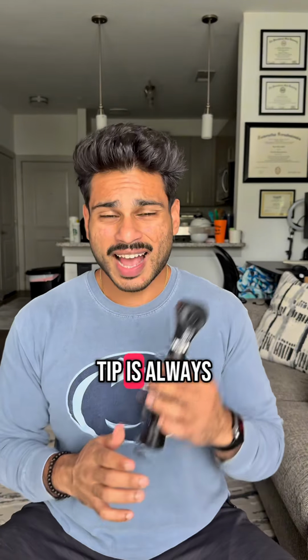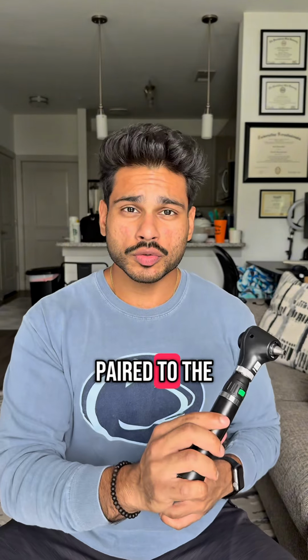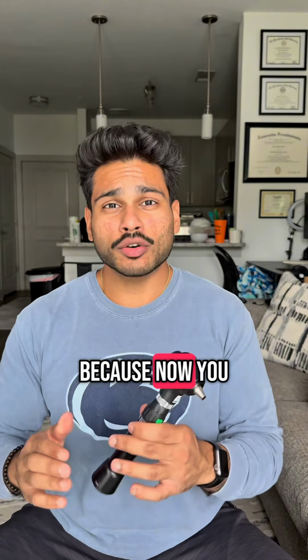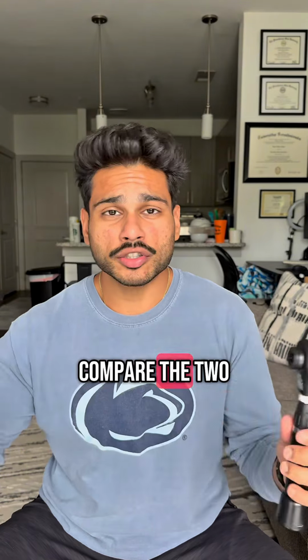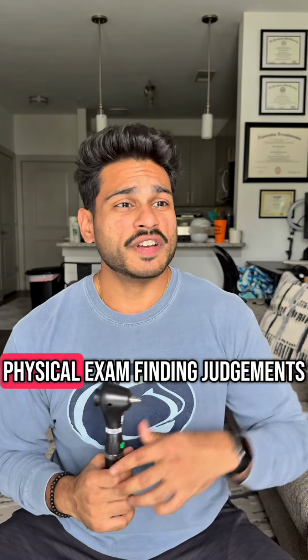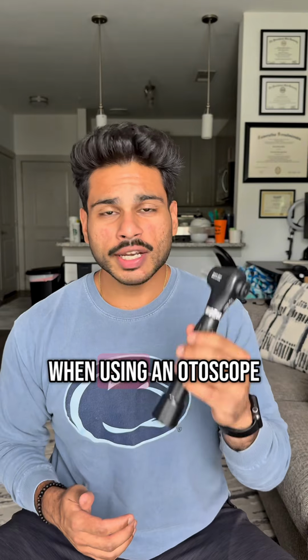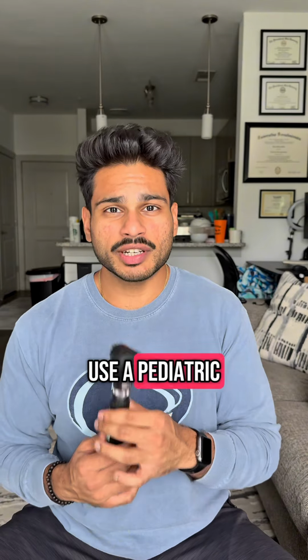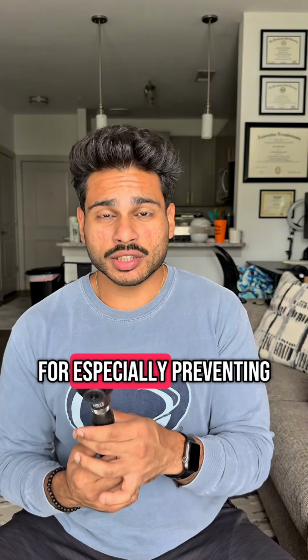My first tip is always look at the normal ear first compared to the bad one, because now you will have a baseline of severity where you can compare the two and then make physical exam finding judgments. Second tip is when using an otoscope, make sure you use a pediatric speculum for pediatric patients, especially for preventing ear canal trauma.